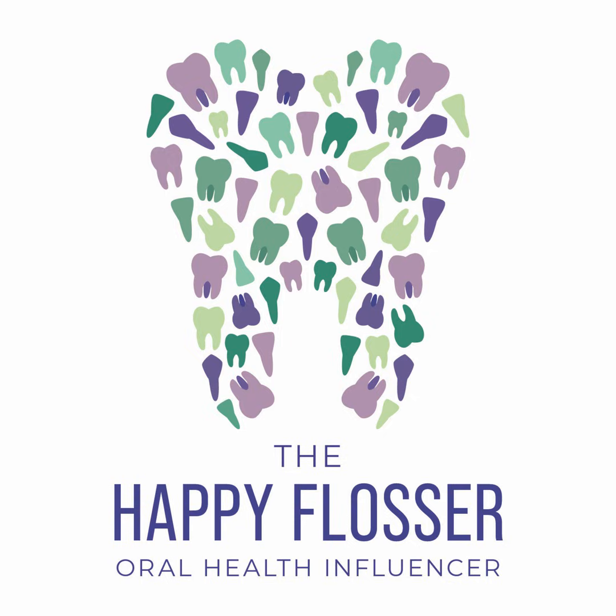When you have true angular vertical bone loss, which is less common than horizontal bone loss, the bone is lost at an angulation, and there'll be a triangle radiolucent appearance where that periodontal ligament fiber ends up at the CEJ line. The base of the pocket would be apical to that alveolar crest in a patient who has true vertical bone loss.